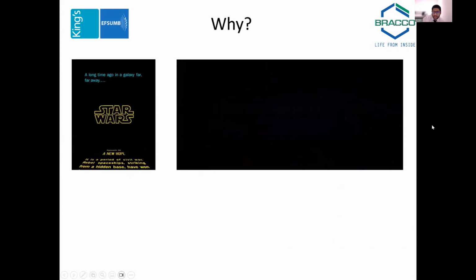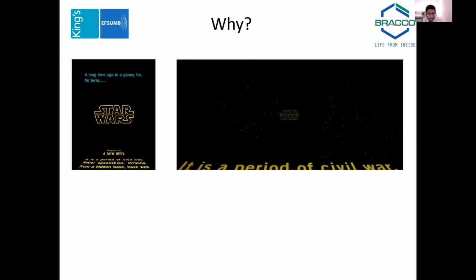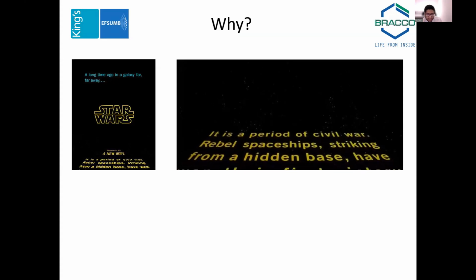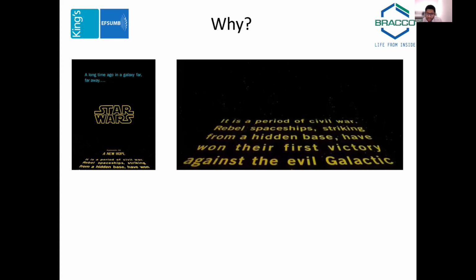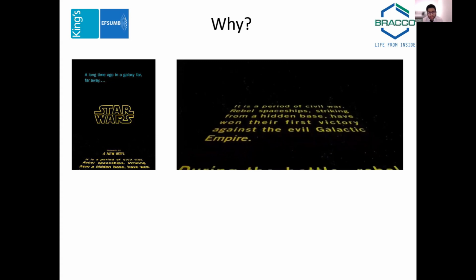Well, why contrast enhanced ultrasound? Well, also, as we heard, it's a dynamic modality. This is a method where you can actually see what's happening. We might think we know how things are going to turn out based on what we see, but it may be entirely different. As you've heard, you're seeing a movie rather than watching a snapshot, a poster, a period of time that someone gives you at various intervals. So you know exactly it's maybe different at the start and therefore it may be different at the finish.